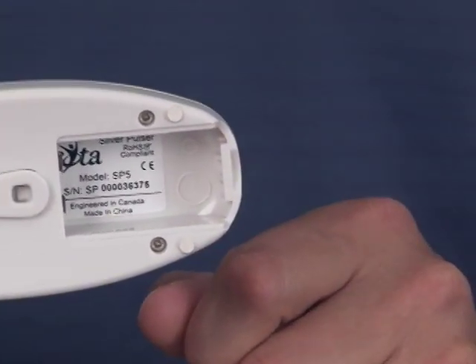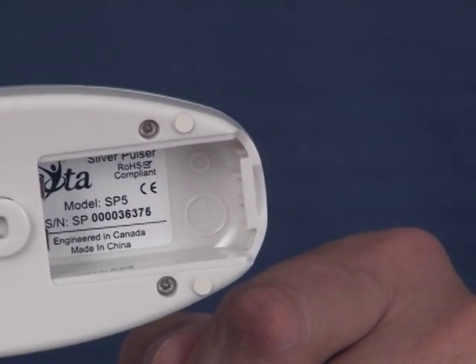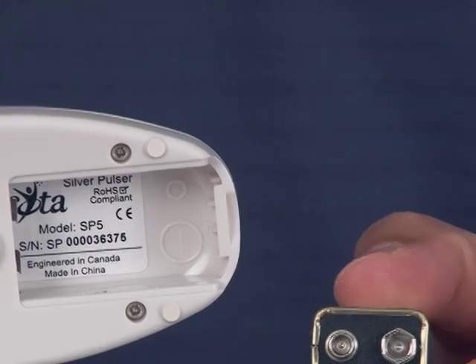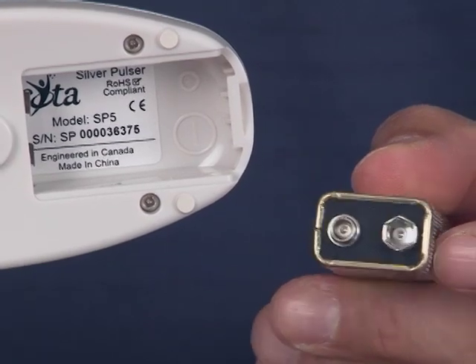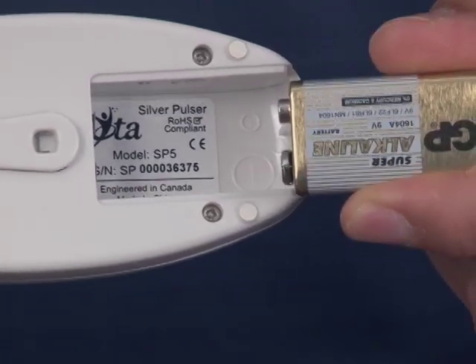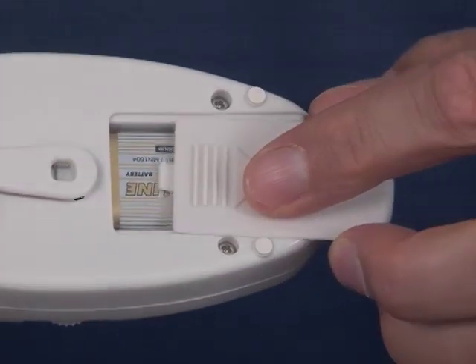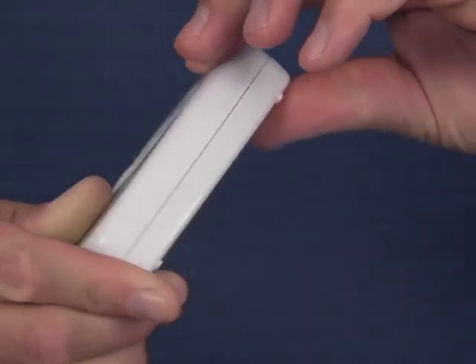Inside the unit there are two plastic rings — a larger ring at the bottom with a negative terminal and a smaller ring at the top. The battery terminals are also different sizes: a larger negative terminal and a smaller positive terminal. Line up the larger negative terminal on the bottom with the larger plastic ring, then simply slide the unit into place and click it in. Put the battery compartment lid back on and turn the unit over.